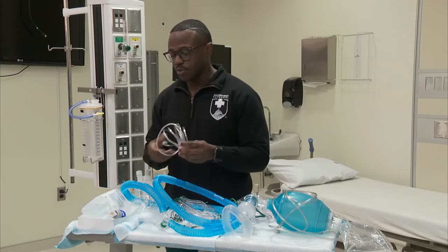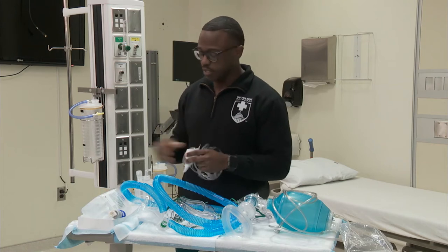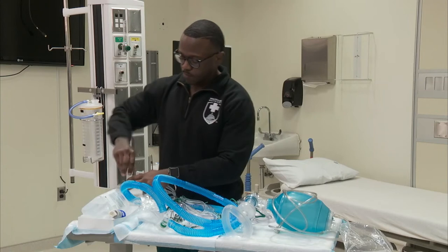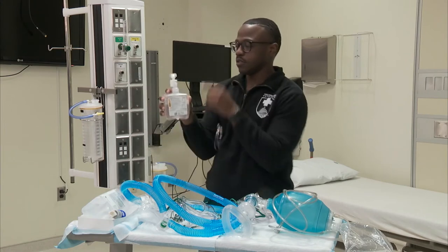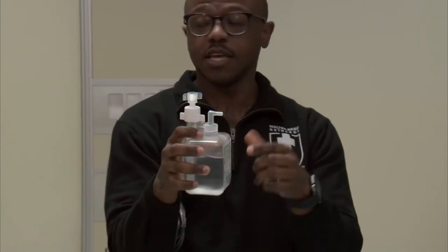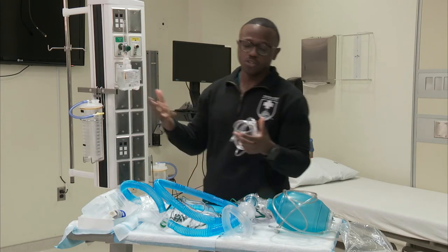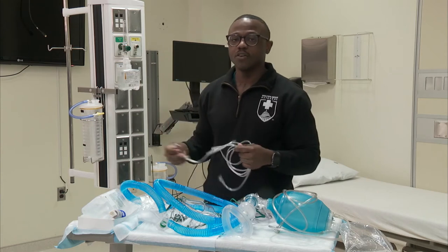I'm going to begin with the nasal cannula. On the med-surge floors, we attach it to a humidifier. We attach the flow meter adapter to it, untwist the knob — that's where the nasal cannula is going to go — and then we twist it straight to a flow meter. With your nasal cannula, the limitations are one to six liters per minute. This bubble humidifier just adds comfort to the patient so it's not just straight dry air or oxygen entering their nares.